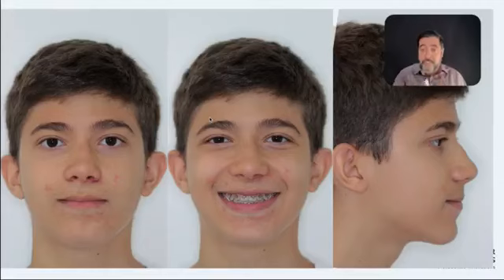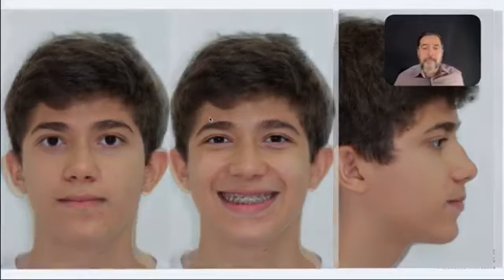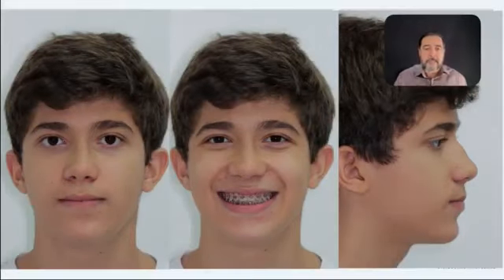Why am I focusing on since the beginning? Because we are applying those elastics on very thin archwires that will not prevent the extrusion. And I don't want the extrusion to be prevented in this condition, because I want the extrusion to rotate the mandible down and backwards. And here we have it after a while.